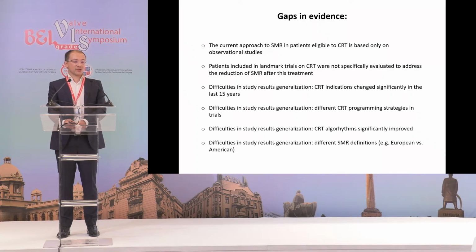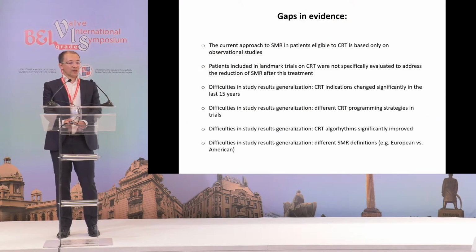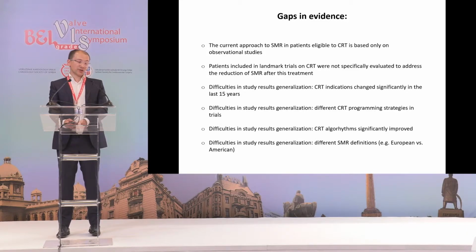CRT indikacije su se značajno promenile, recimo u poslednjih 15 godina. Postoje značajne teškoće u interpretaciji rezultata, jer postoje različite strategije programiranja koje su se takođe vremenom menjale, a CRT algoritmi su se takođe promenili na bolje.